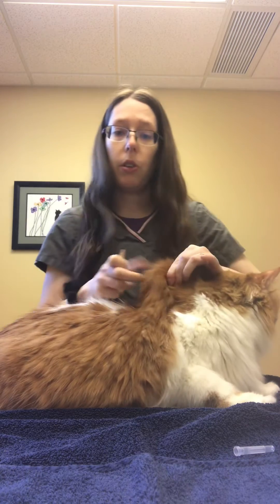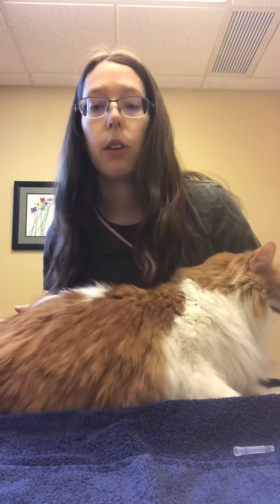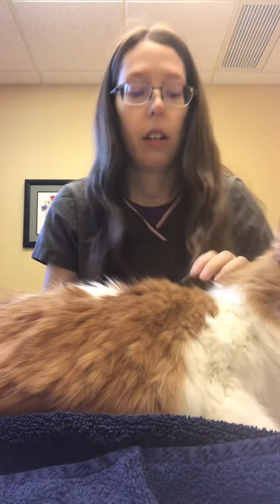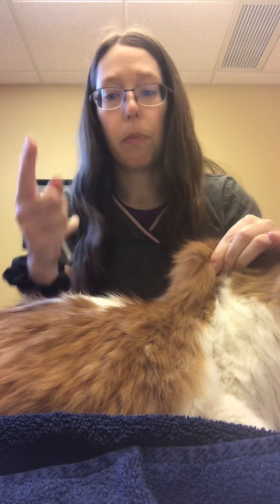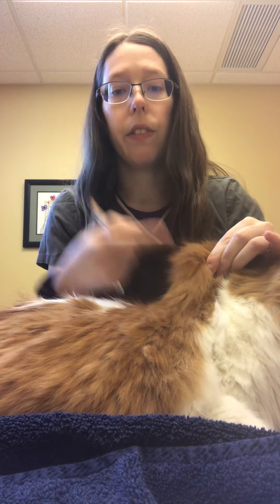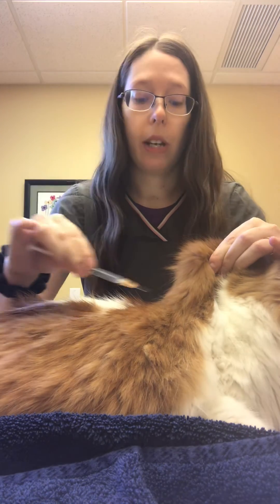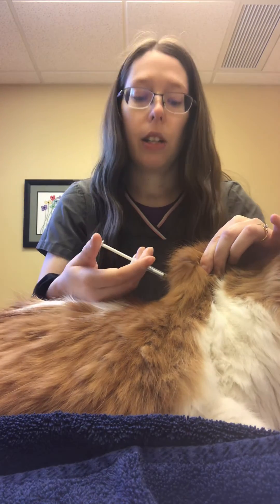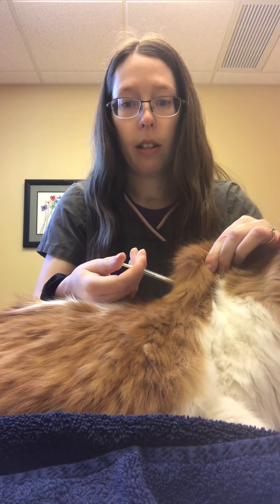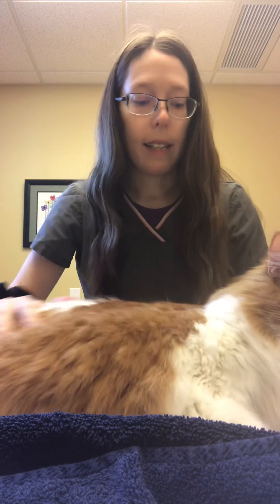You can take your cap off. You pull this loose skin up and it makes sort of like a tent. You can poke with your index finger in there and feel kind of like a triangle tent. And you're just going to poke your needle straight in there — I'm actually in right now, I poked all the way in. You give your injection and then you come back out. Just like that. Good job, buddy.